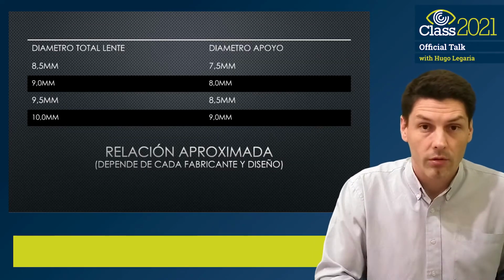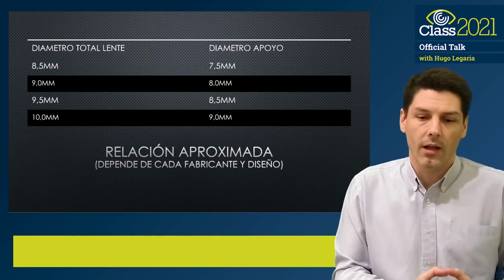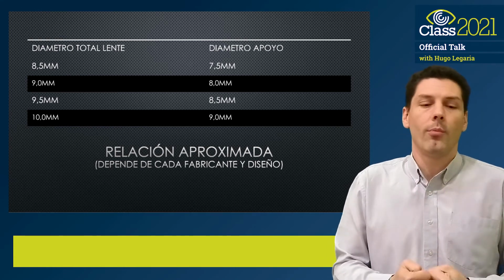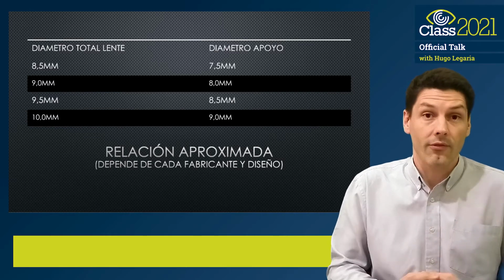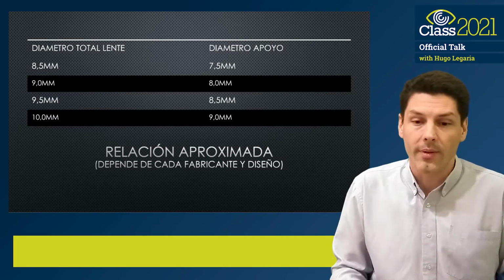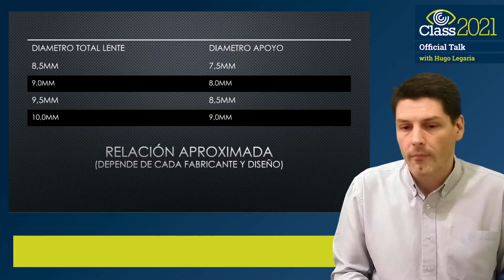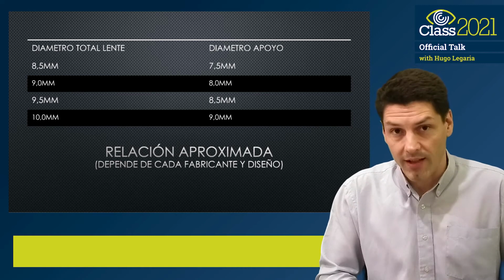I will first explain how it would be in the case when one works with the topographic report. In that case, it is important to ask the patient that when they give the topography, either on disc, 3D or printed, that they give the elevation map to be able to obtain the numerical values of elevation difference.